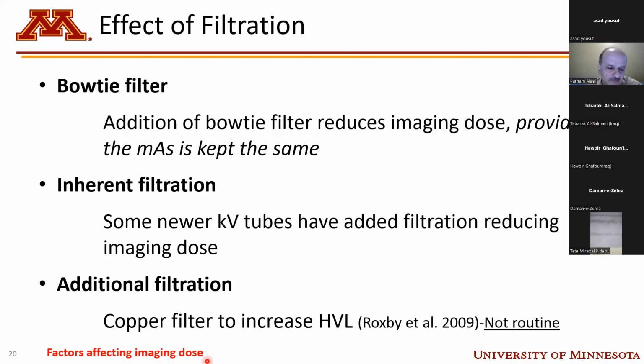And then this last one, additional filtration. This was an attempt by a few to manually add filters. This is not a routine thing to be used, and there was just a study published. Obviously if you add filter, you could lower the dose, but you may lose image quality as well, potentially.